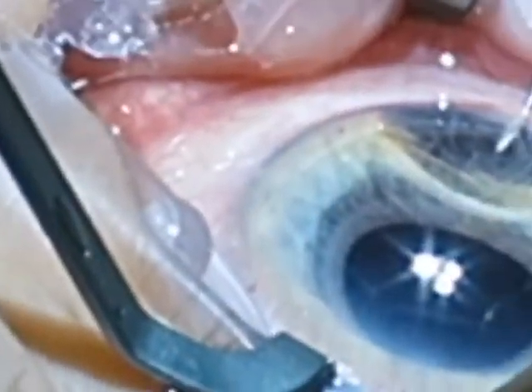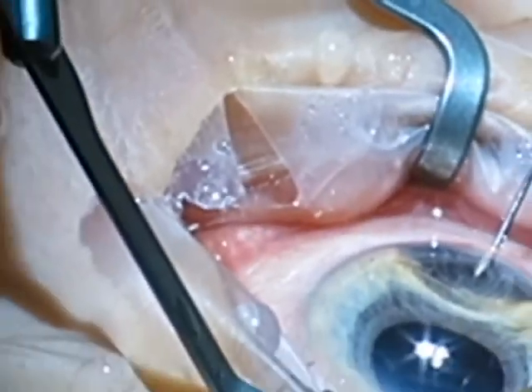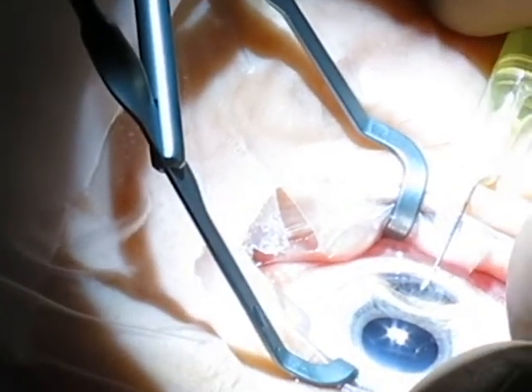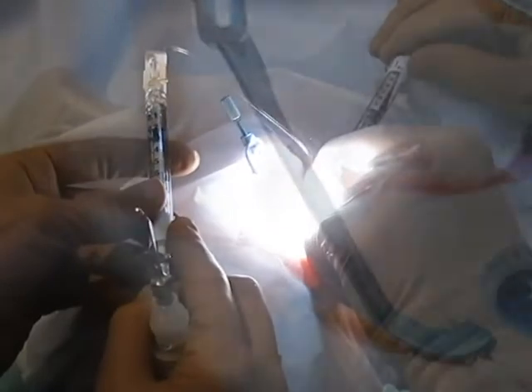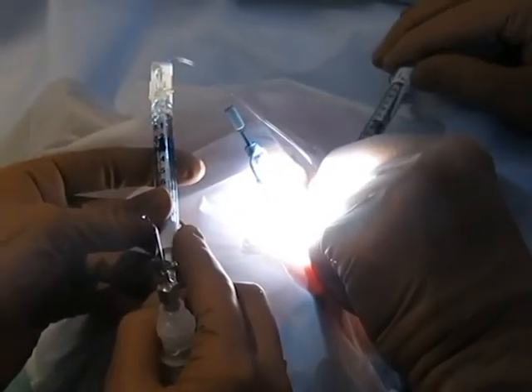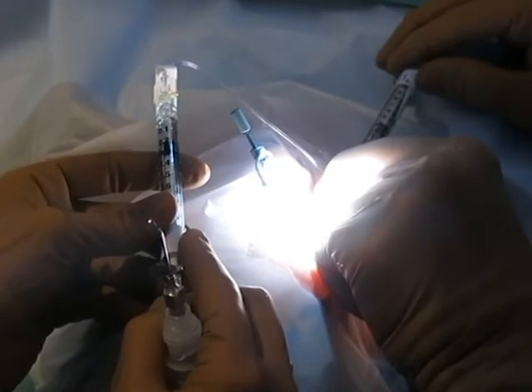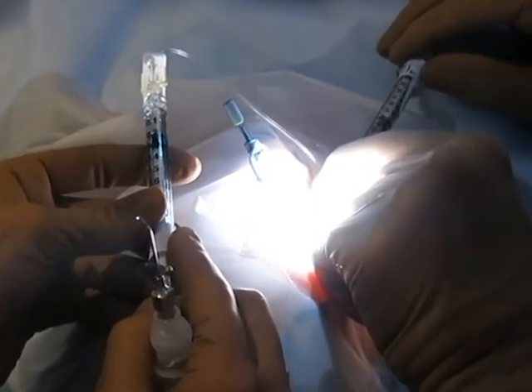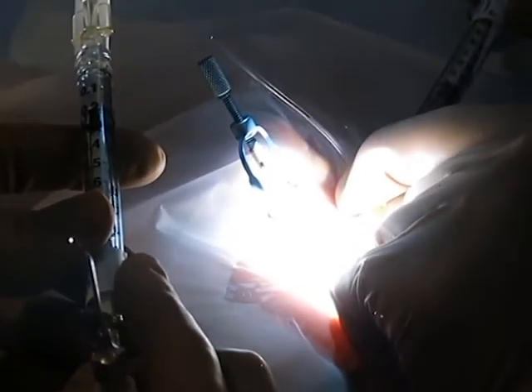Here's another view shot with a cell phone video — the quality is limited, but it shows the setup. The surgeon holds the needle in position, and because of the delicacy of the aspiration and irrigation, I like to use an assistant to control one or the other of the syringes. This allows for fairly precise control of the volume and reduces the risk of rupturing the cyst.